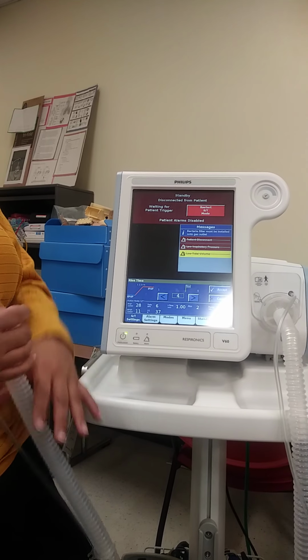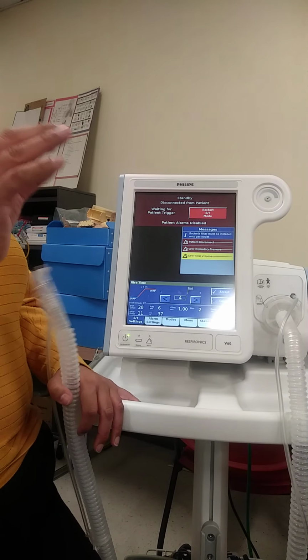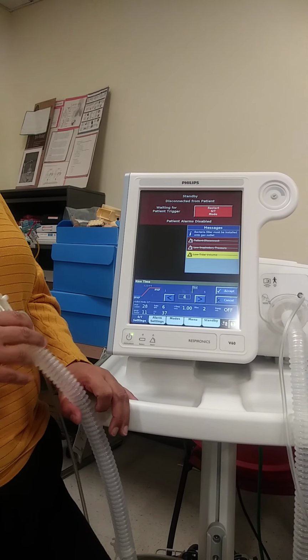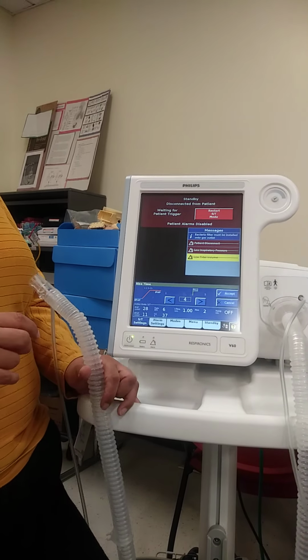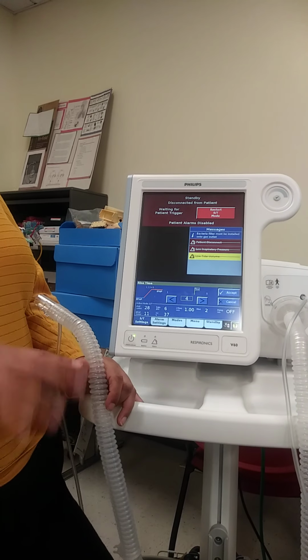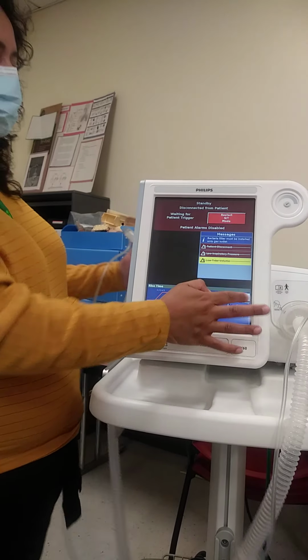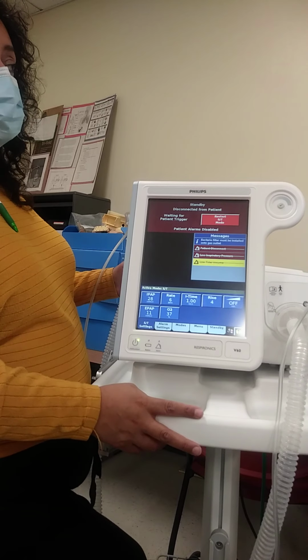Okay? So this is all patient comfort. There's no textbook where it says set it at 3 for this. It's more like my patient's coming in, they're having a hard time breathing, I'm going to set it to 2 right now. Oh, your breathing looks a lot better now. Don't tell them what you're doing, just fine tune things. So those are your settings.